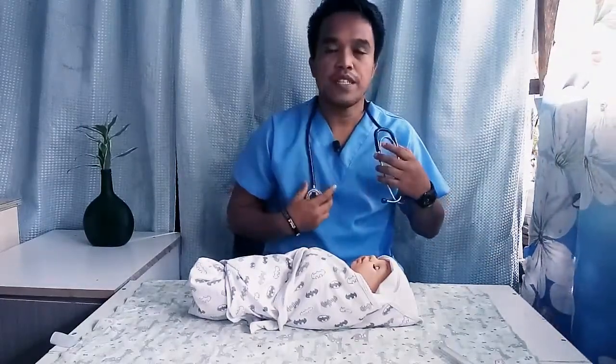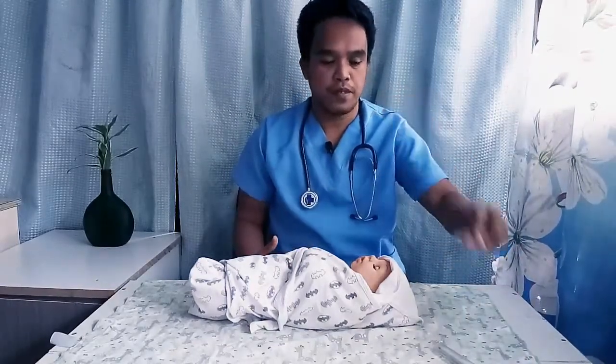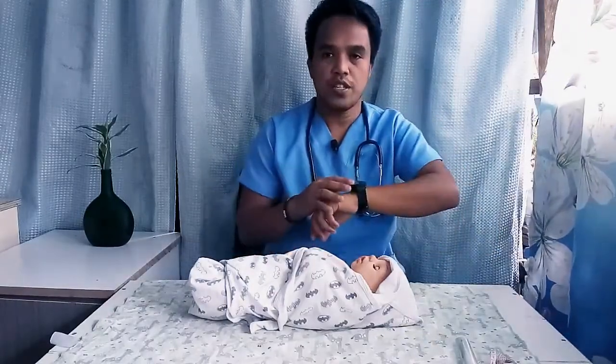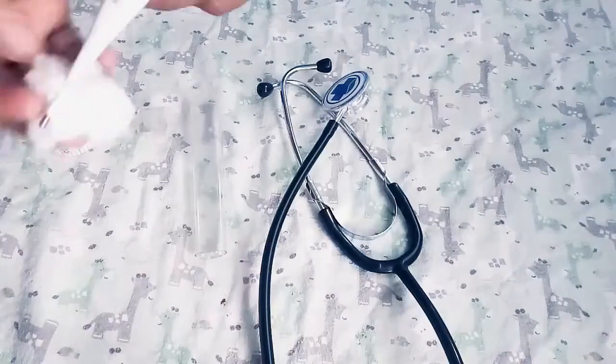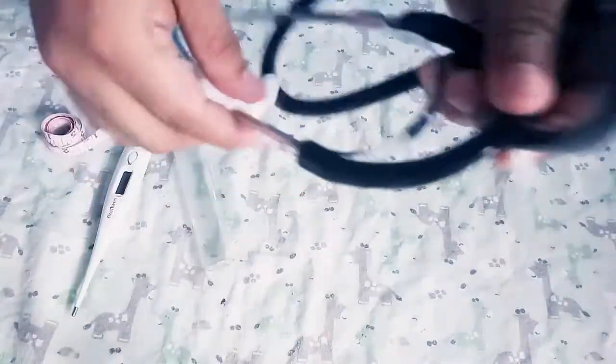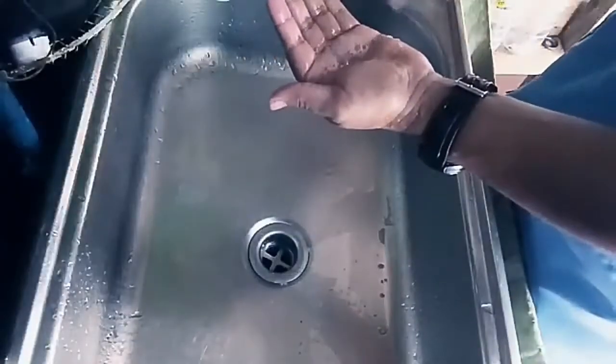What you are going to need is an infant-sized stethoscope, measuring tape, thermometer, scale, and a watch. Make sure you sanitize everything that you will use before and after. And of course, wash your hands.